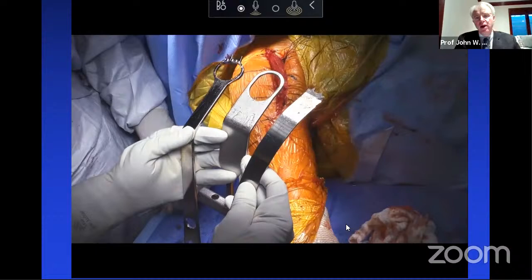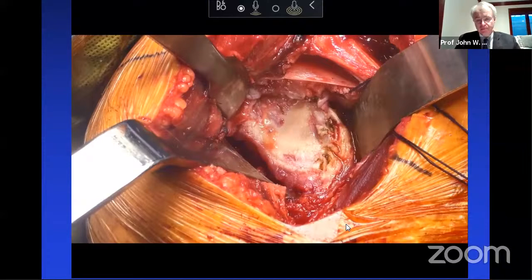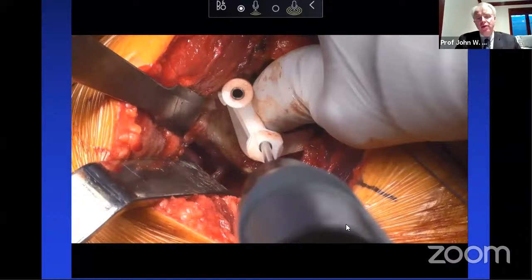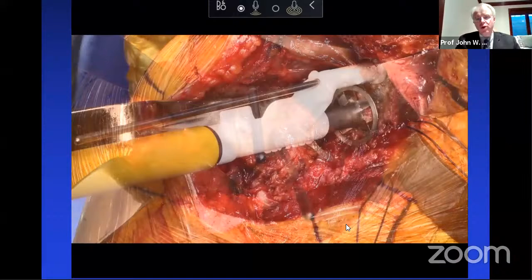So what we'll do now is we'll remove the labrum circumferentially, as you can see in this case. We'll place a Batman retractor in the front. We want to see the entire glenoid surface, and then we'll place the guide on there. So the first pin we'll be able to go ahead, and that's where we're going to place our implant. The second one is more superior, and that's going to assist me with depth control. So we know we're down there, and now we're going to ream the glenoid. We want to ream a minimal amount of the glenoid bone away.